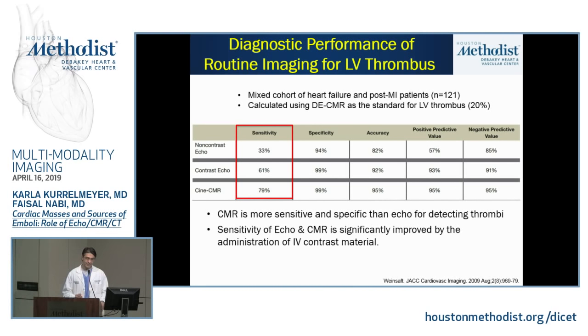This was still inferior to cine CMR imaging. I think in our own experiences as echocardiographers, we would agree that generally contrast is very, very beneficial, and Dr. Zogby has shown many slides where contrast really saves the day and can help you make the correct diagnosis. Obviously, if you do see what you believe is thrombus by a non-contrast echo or contrast echo, the vast majority of the times you are absolutely correct.